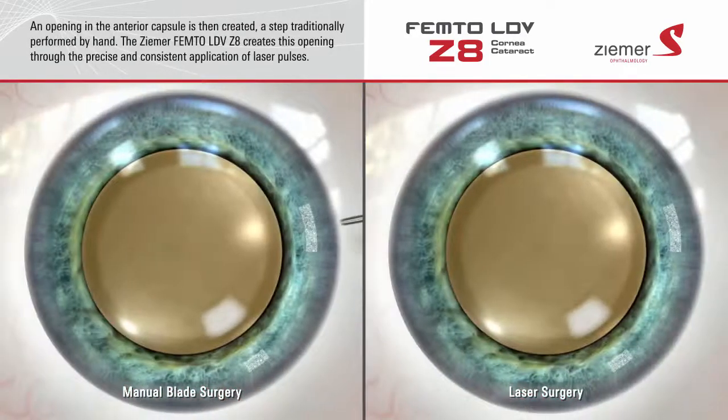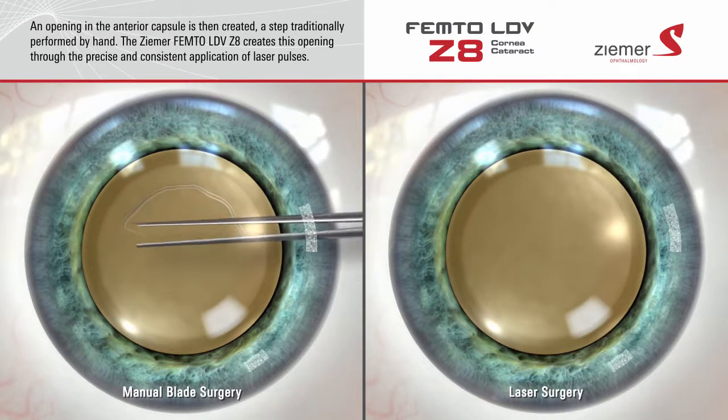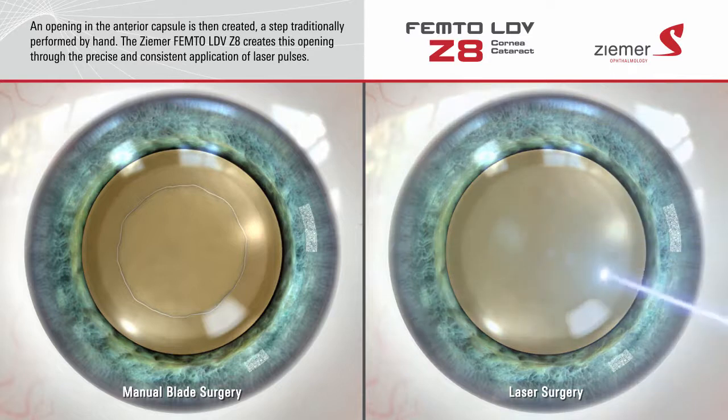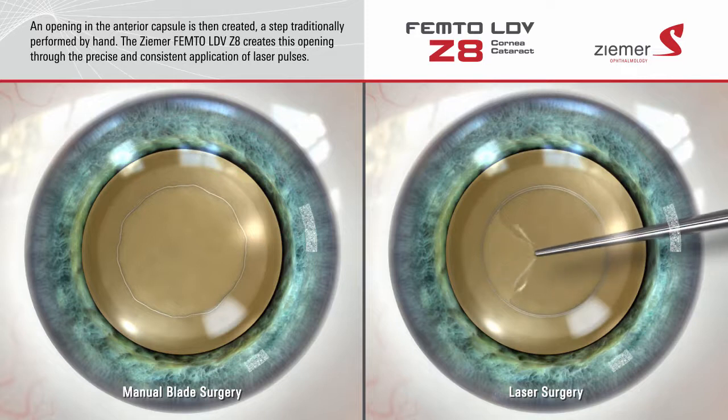Once an incision has been made through the cornea, the next step is to create an opening in the anterior capsule of the lens, a step traditionally performed by hand. The Zeemer Z8 laser can create this opening in a manner that is much more precise and consistent than is possible with manual techniques.